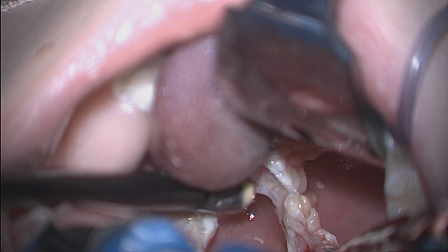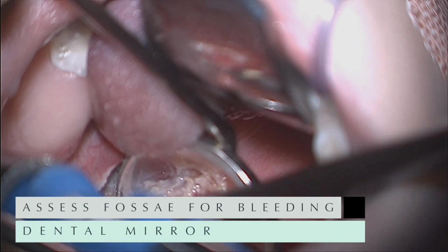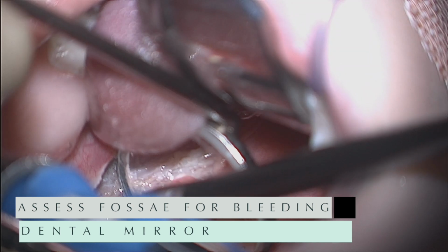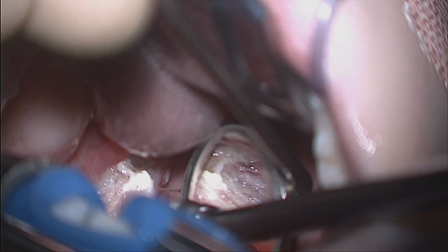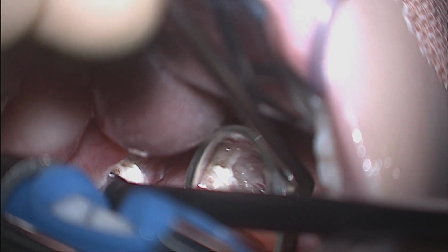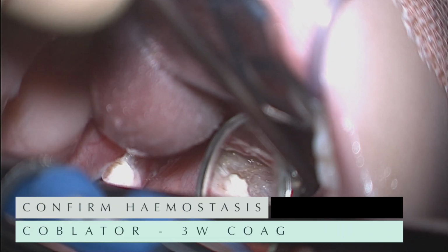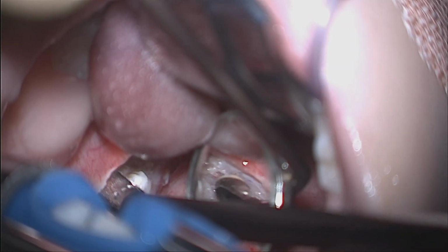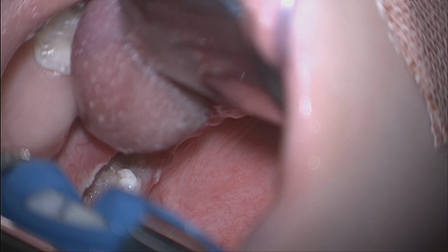Once both tonsils have been removed, I like to inspect the fossae using a dental mirror. This allows the entire fossa to be inspected systematically with no blind spots. Judicious and targeted cautery is applied to any bleeding areas or any superficially visible blood vessels which may not be actively bleeding but carry a risk of secondary hemorrhage.